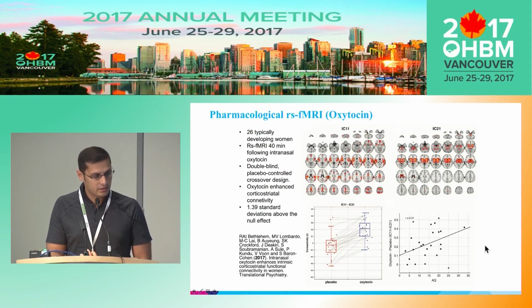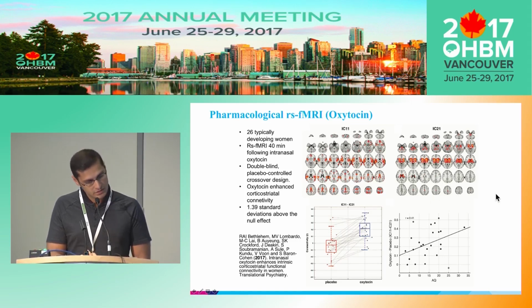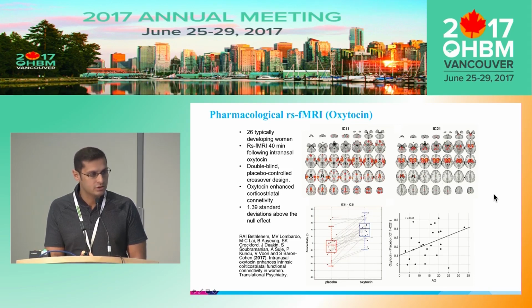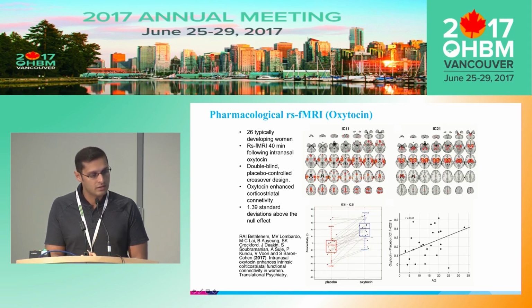In our paper, Mike and I also worked together, led by Rich Bethlehem, to show whether oxytocin changes functional connectivity. Using a dual regression approach, we found using multi-echo ICA a very strong shift in oxytocin-related inter-network interactions. Essentially you had an increased interaction between the insula network and the subcortical network.